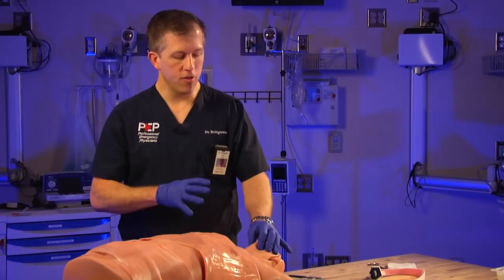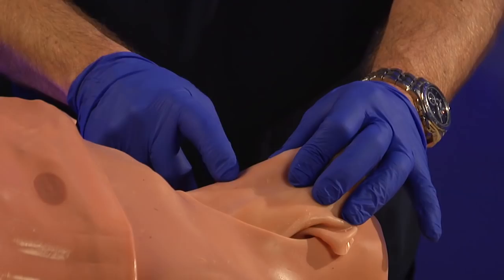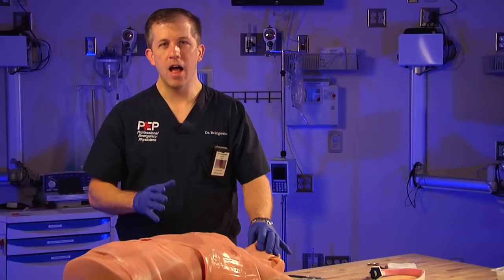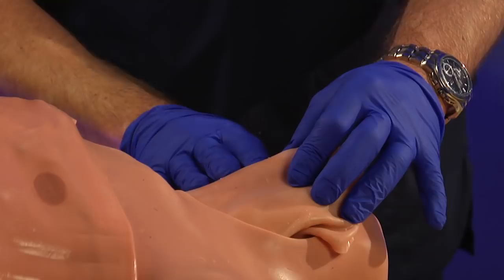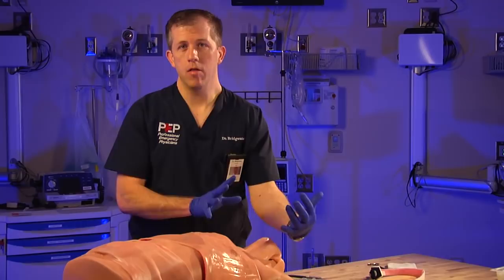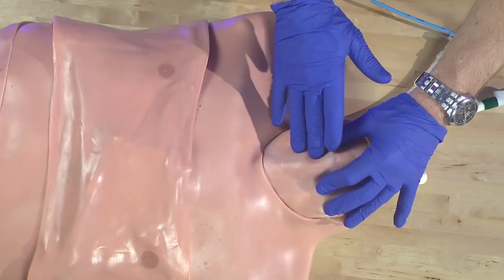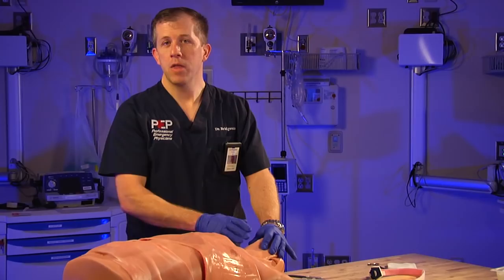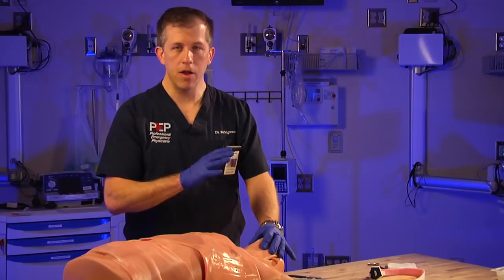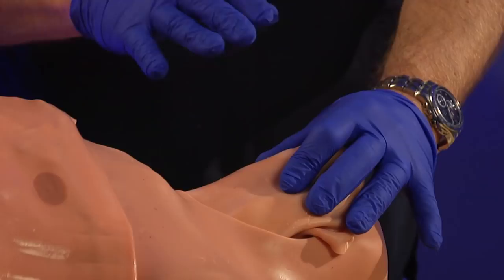In a patient with a difficult airway, mark the landmark long before you have to act. Have your equipment out, ready, and easily accessible so if you have to move to this procedure, it won't be in a hurried or rushed manner. Stay in the midline because on either side you have the thyroid gland, which is very vascular. If you stay in the midline and away from the arteries and veins feeding the thyroid, you'll have a much less bloody field.